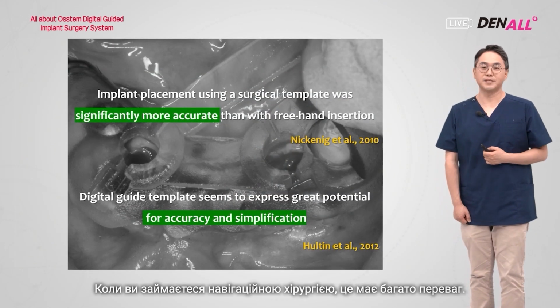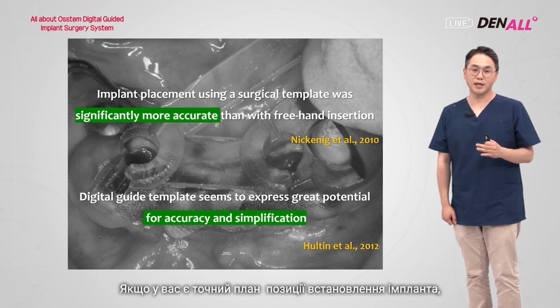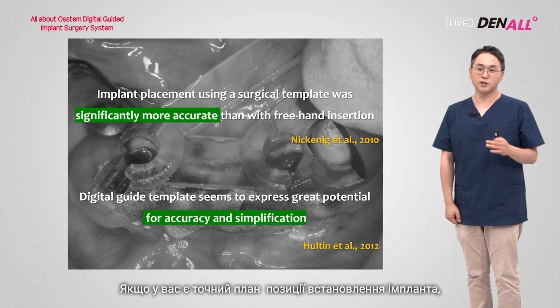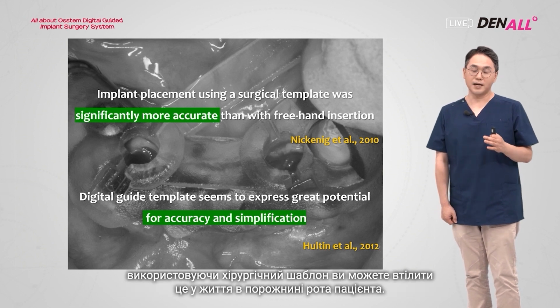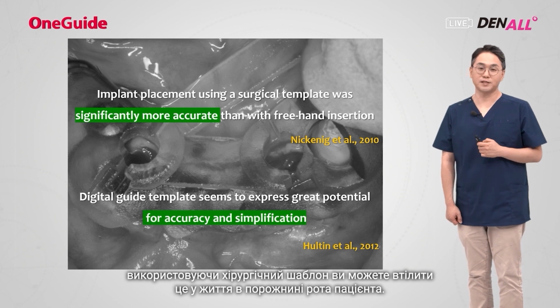When you do guided surgery, there are many advantages. First is accuracy. If you have an accurate plan, the planned position, you can use a surgical template to make it into a reality in the patient's mouth.